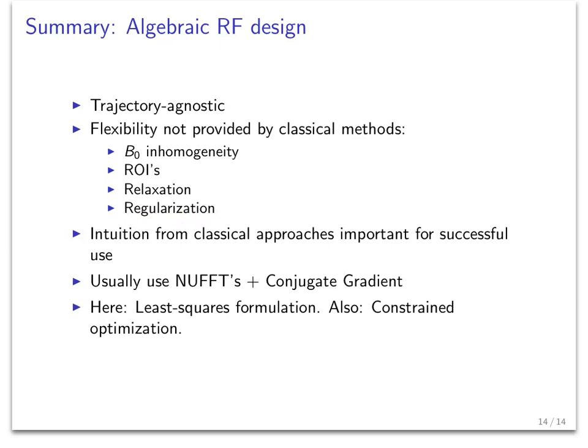And so what we can do is encourage our pulse designs to yield pulses with fewer rapid changes in the envelopes, right? You can imagine that this pulse has a lot of rapid changes in its envelope, but we might like to instead have a pulse that gives us something more like that, right? So I came up with a way to regularize the envelope of the RF pulse, and I was able to get pulses that subsequently gave a more accurate excitation pattern because the amplifiers didn't distort them as much, okay?